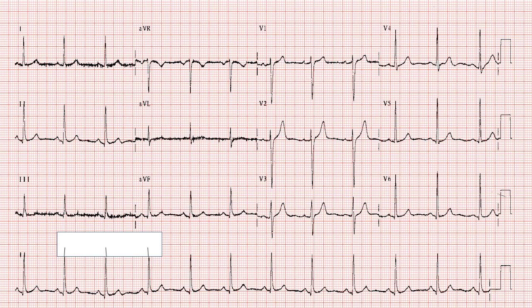Now you have to slide the paper. Picking the last one, place the first mark in there, so slide your paper there. Now your paper is there, and check if the remaining QRS complexes match. If they do, in this case, that's regular. Okay, so it is a regular rhythm.